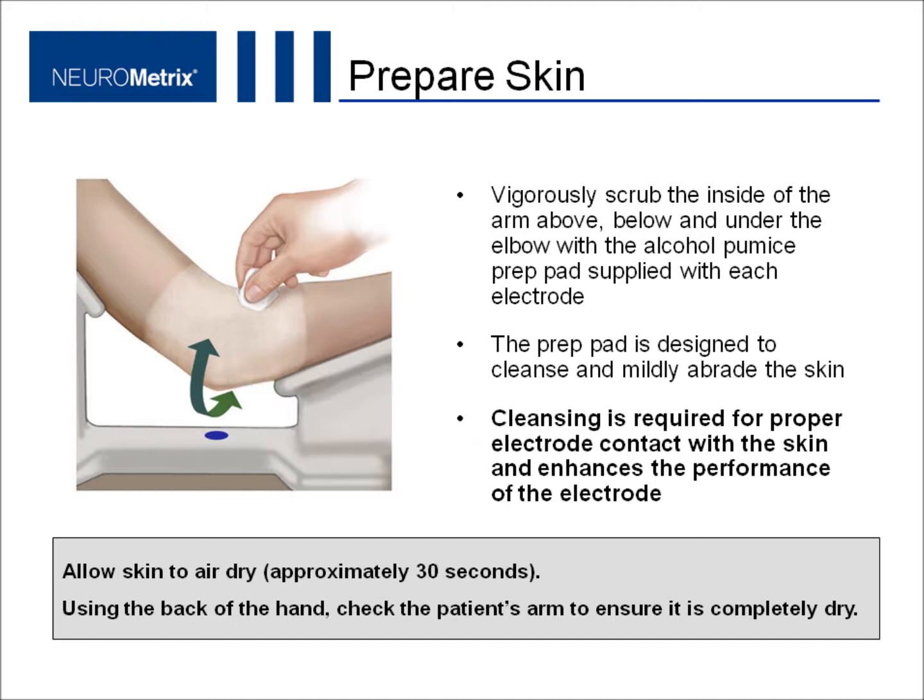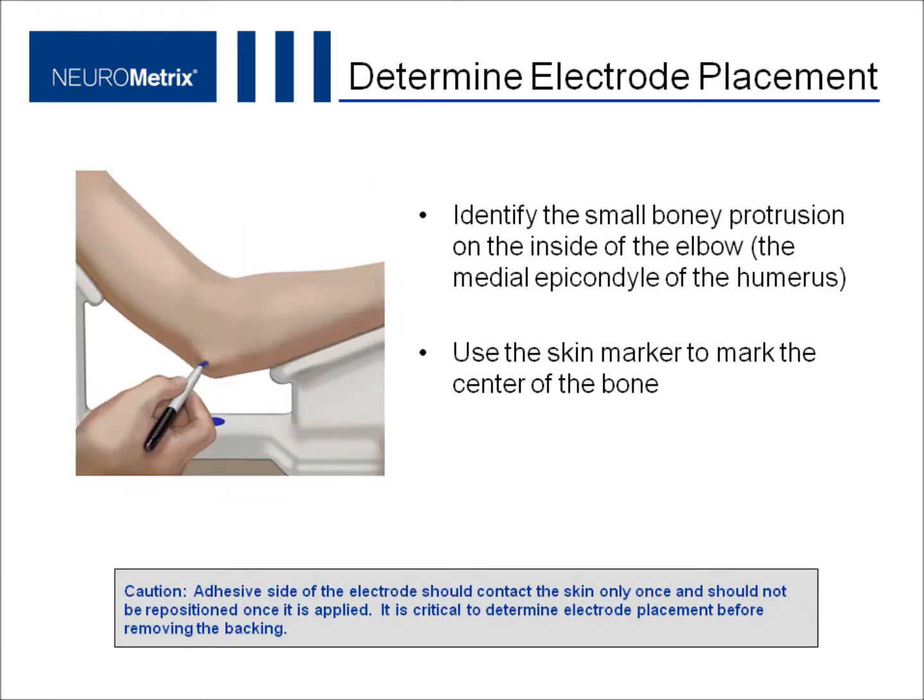Using the back of your hand, check the patient's skin to ensure it is completely dry. A word of caution: the adhesive side of the electrode should contact the skin only once and should not be repositioned once it is applied. It is critical to determine electrode placement before removing the backing.